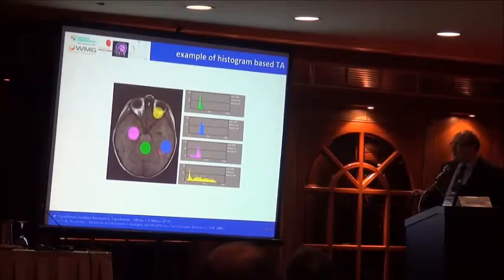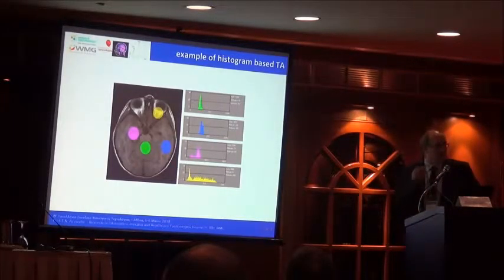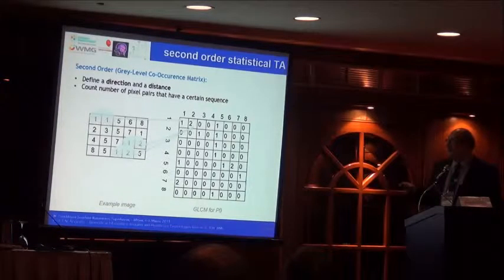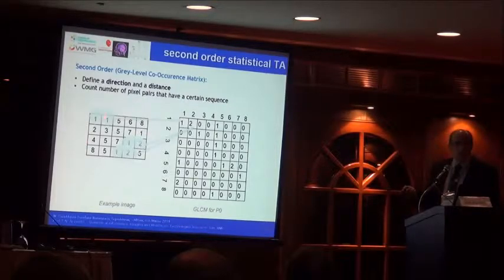But it's interesting that if you look at the small variations into grey, white matter, the different regions show you distinct histogram differences. So we have more detail than the human vision can discern. That's very important. Now, the second order is more interesting because it looks at interesting patterns within an image. So, for example, we can look at patterns of pairs of pixels. So, in this case, we go to a particular direction in an example image space, and we count how many of these pixels might have the same value.